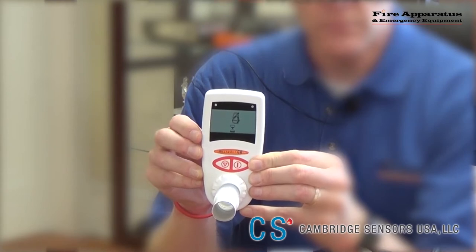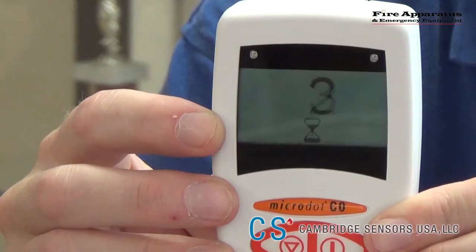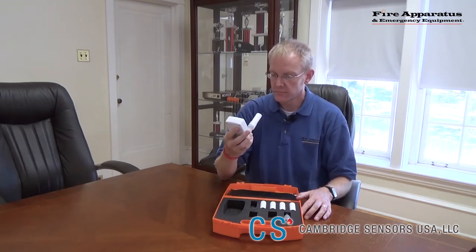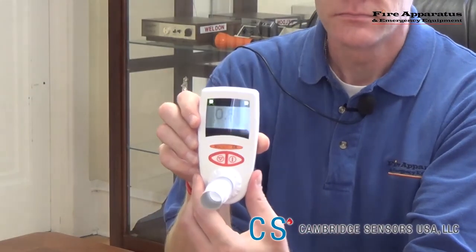Once the countdown is over, the analyzer will show a person blowing signal. Blow into the tube for as long as you can. The most important part of the exhale into the analyzer is the last one-third of air in your lungs, which will usually contain the most CO. If a person is short of breath or has COPD and can only get a few seconds of exhale breath, that is okay because the analyzer will still provide a reading.